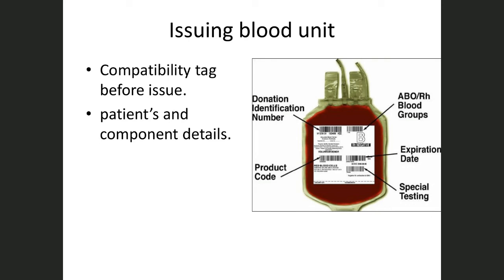Okay, let's go back. We just finished talking about cross matching and how to select a compatible unit. What are the important phases in cross matching? Let's talk now about how to issue the blood units.